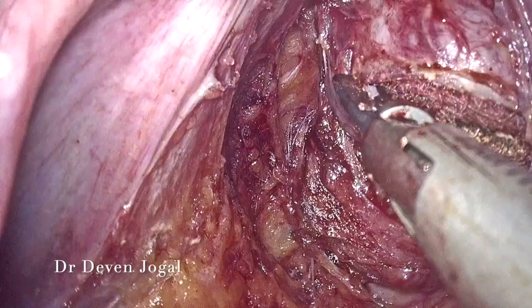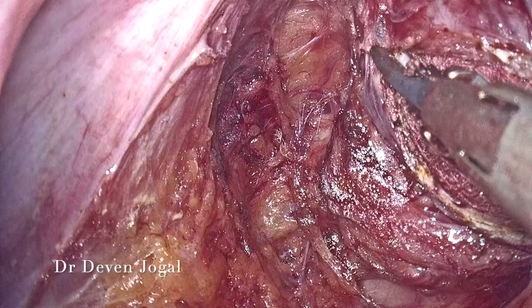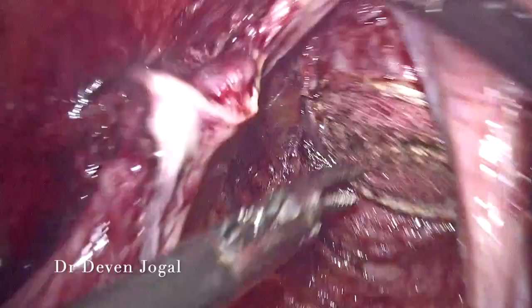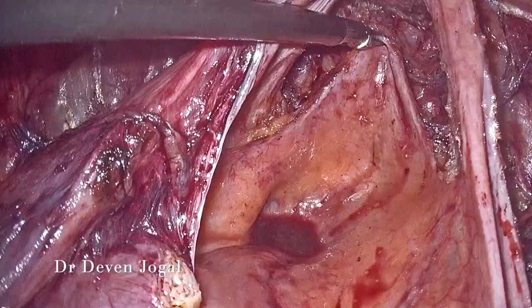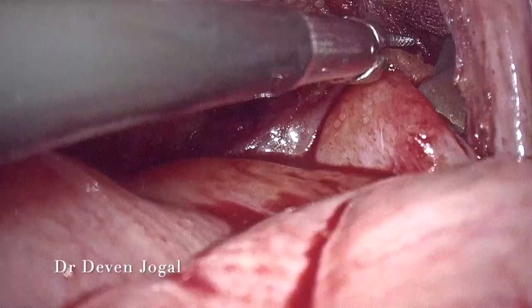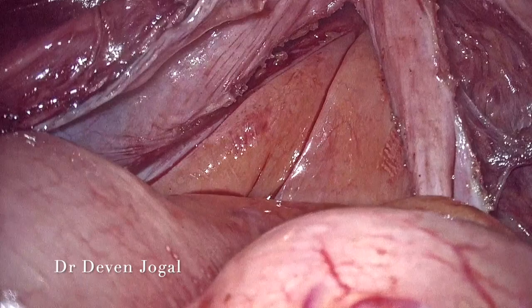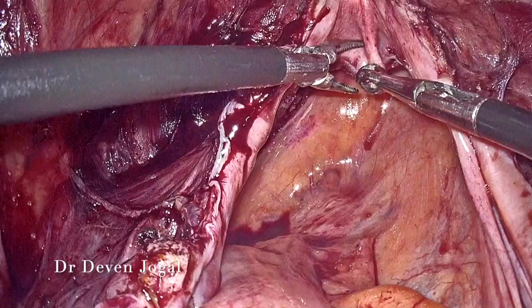People prefer Davydov vaginoplasty over McIndoe vaginoplasty because in McIndoe vaginoplasty we need to use a graft — be it an amnion graft or a skin graft — but in Davydov vaginoplasty we use the peritoneum itself to line the vagina. You can see the Ellis forcep being used to pull out the posterior vaginal fold that we have created.